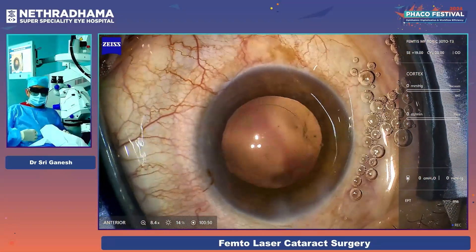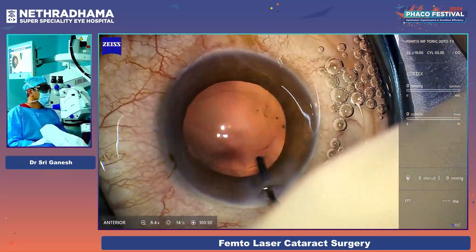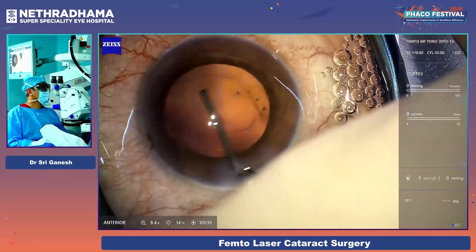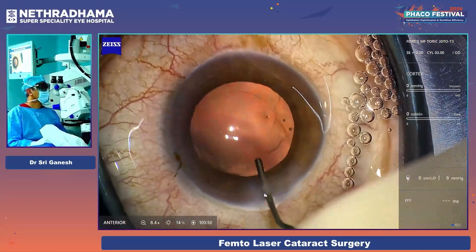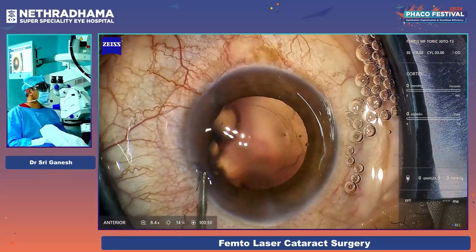That is the sub-incisional cortex which is cleared because I have a high flow rate and the chamber is stable. It is very easy to remove the sub-incisional cortex. I am hydro-polishing the posterior capsule and the fornix, which reduces the incidence of PCO. I do that routinely.